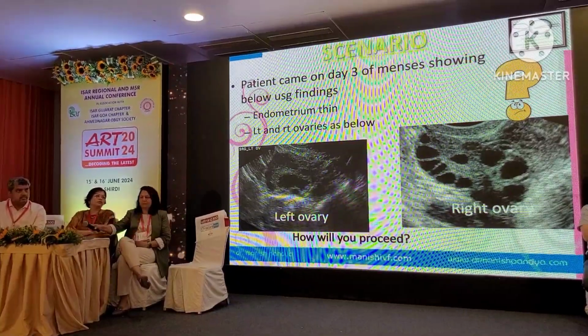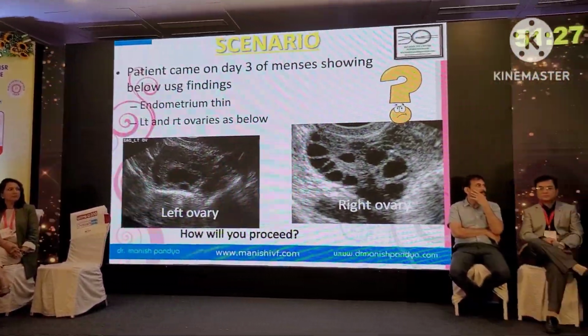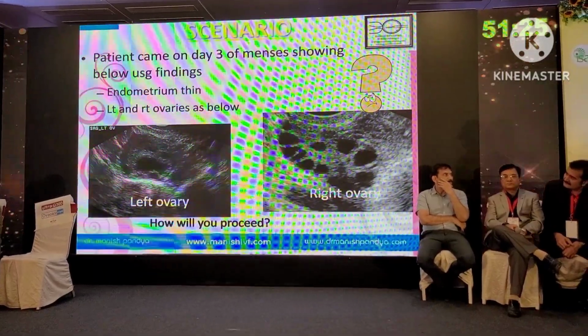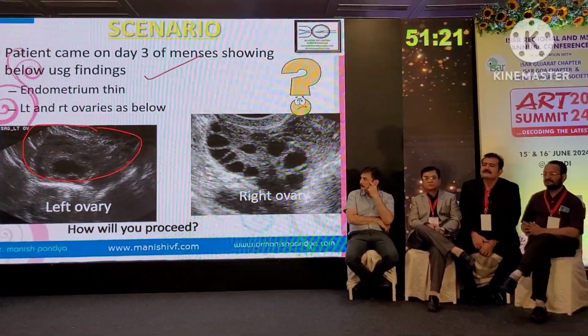That will come later, because this is the situation, sir. Yes, mainly, sir. Correct. So here, the patient has come on day 3 showing the below findings. Thin endometrium, left and right ovaries are as below.